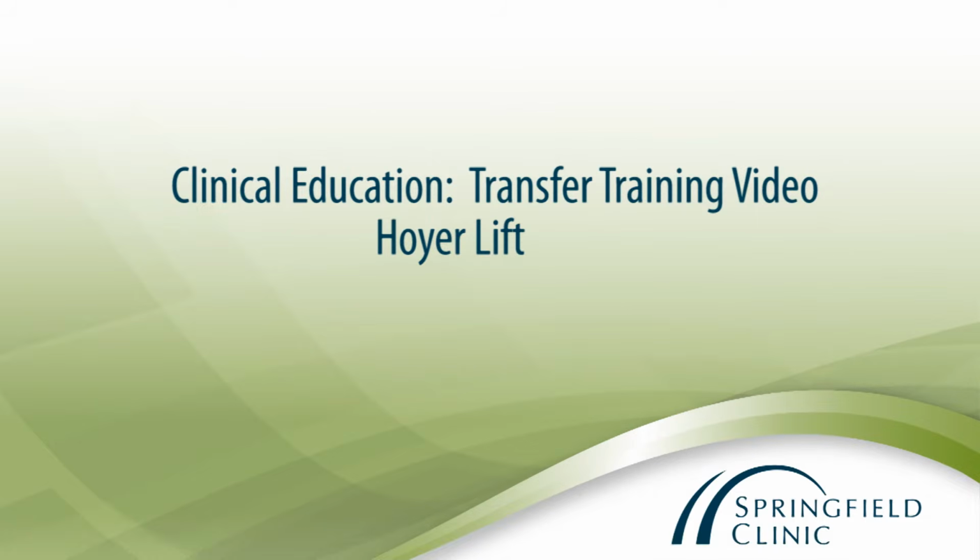Today I will show you the proper way to transfer a patient while using a Hoyer lift. Any patient requiring a Hoyer lift transfer should come to you with the sling under their body already. These patients may also have a caregiver with them who can also assist or explain how the transfer is performed at home. If the patient does not have a sling under them, I will show you how to place the sling as well. Explain to the patient what you plan to do.